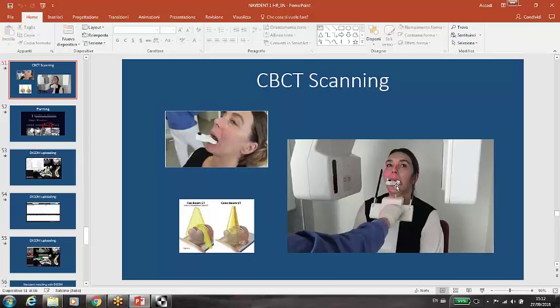But if you have a tensed patient, then the patient tends to move. Then the patient tends to dislocate the Navi stent. Then the patient tends to do things which are not good for Navident. The patient should be at ease wearing a Navi stent, should be relaxed and should be capable of maintaining a position for 1 minute, 60 seconds. If the patient is tense or under pressure, then you might risk getting a DICOM which is not the one that suits your needs.